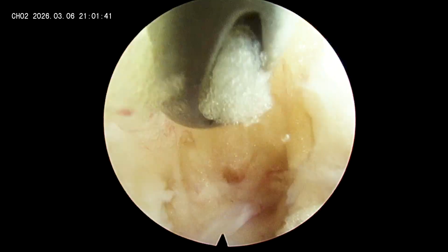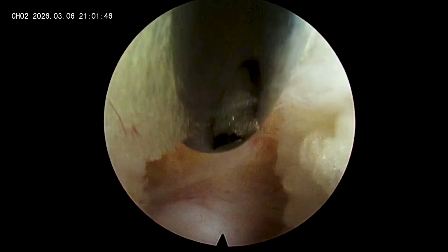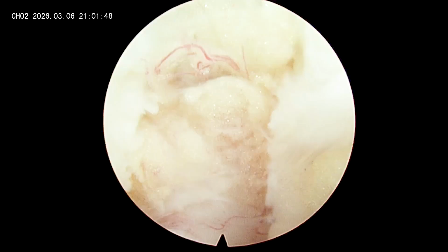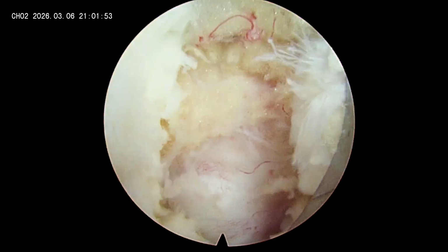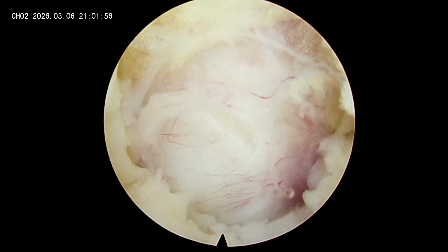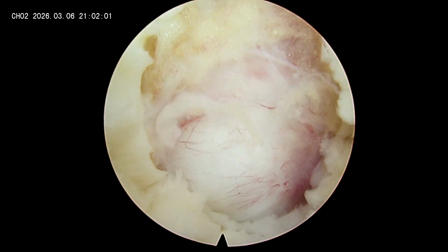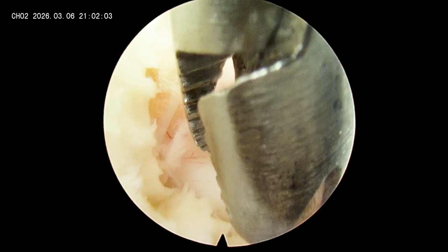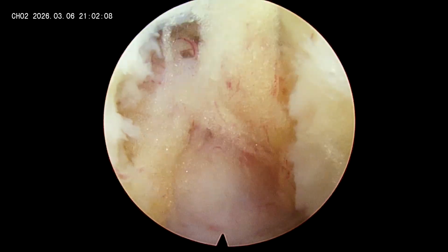Because even at this stage, I am not sure whether I am touching the traversing nerve root here, or I am landing on the disc. So I'm just removing the tissues in the interlaminar space to identify the traversing nerve root. Now look at the structure lying in front of me. It might be a root or it might be a disc fragment as well.